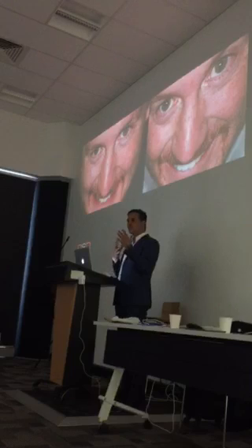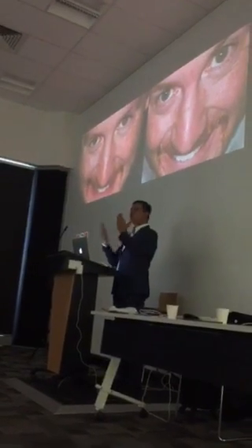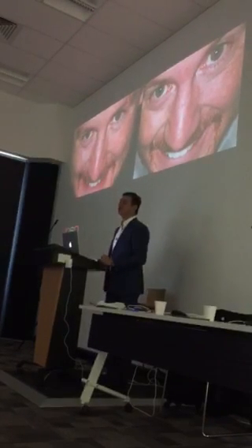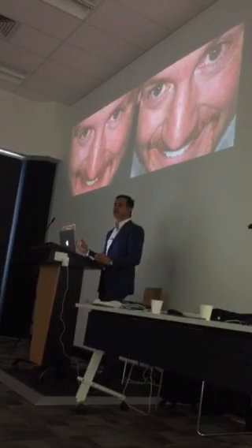The idea is that you want to show them the proportion, the facially driven design, before and after. But even just blacking out looks amazing on a photo. You don't see that. But yeah, and then you've got to make that decision as well.